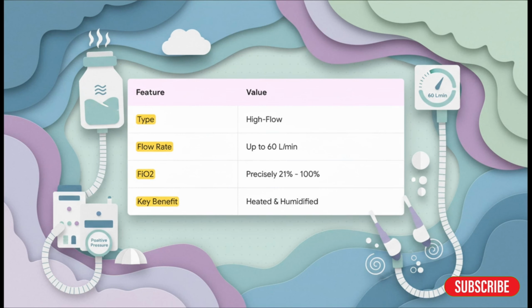Okay, now for a serious step up in support. High-flow nasal cannula, or HFNC. This thing is a game changer. It can deliver oxygen at crazy high flow rates. We're talking up to 60 liters a minute. But its real magic is in the comfort and the function. The air is heated and humidified, so it's way easier for patients to tolerate. It helps wash out CO2 from their airways, and it even provides a little bit of positive pressure, what we call PEEP, to help keep their lungs open.